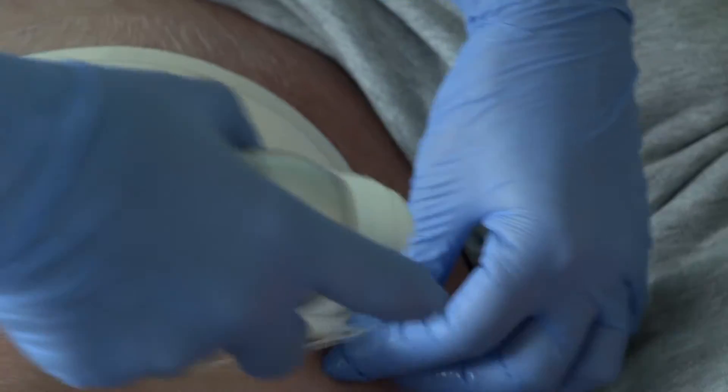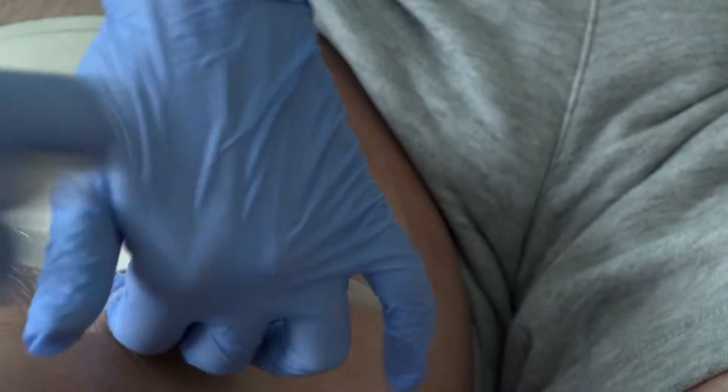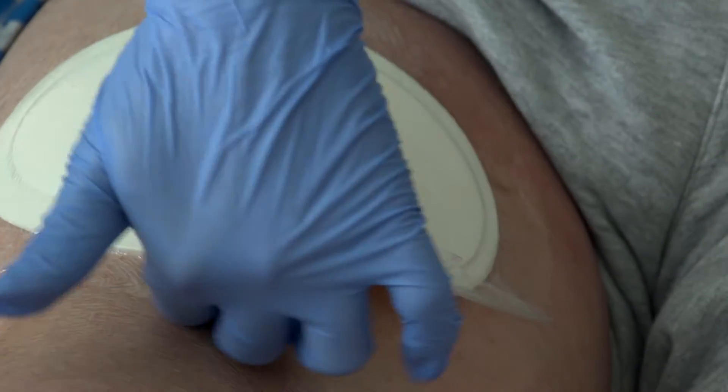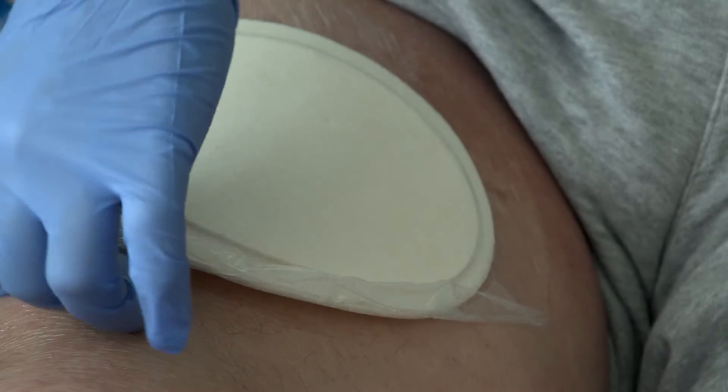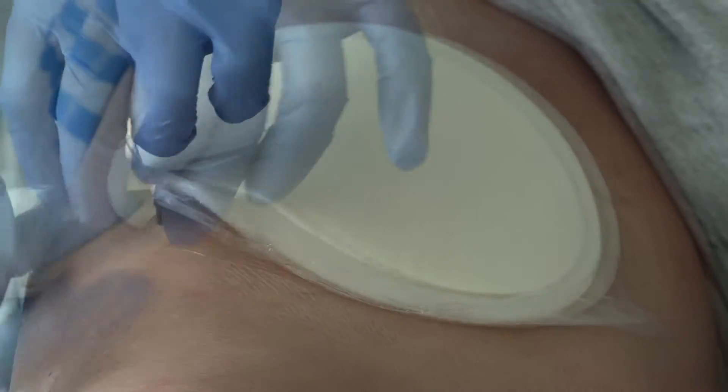Spray under one edge of an impermeable dressing as shown here and repeat for complete removal. For permeable dressings, spray onto the adhesive area.